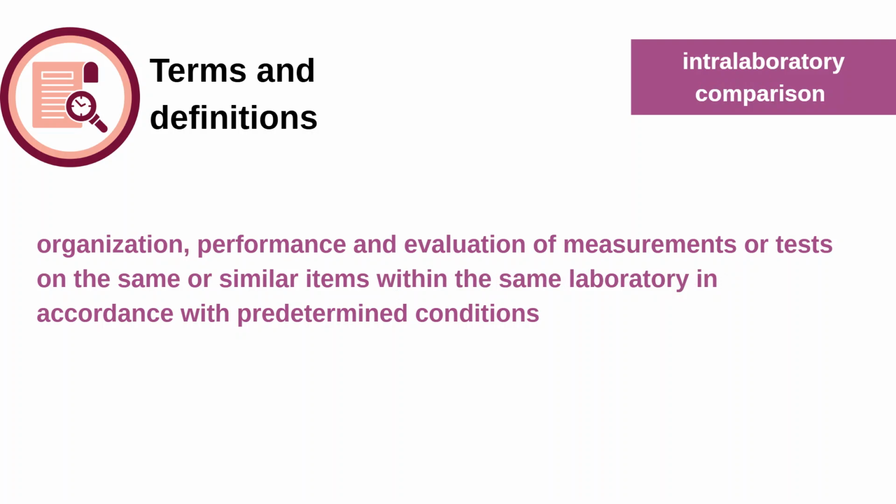There will be some predetermined conditions like how the lighting should be, how the temperature should be, how the humidity should be. They set some predefined conditions. And then, for example, if I want to measure the volume output of a ventilator, what value am I getting? What value am I setting in my calibrating master device?